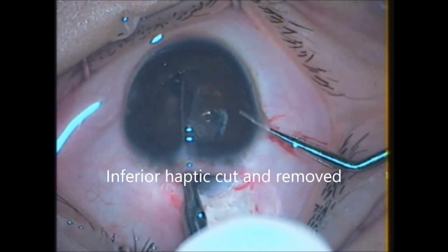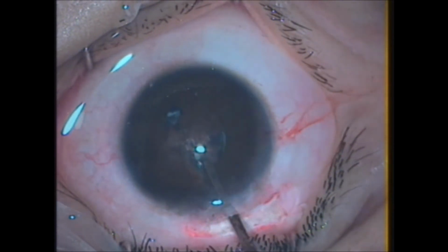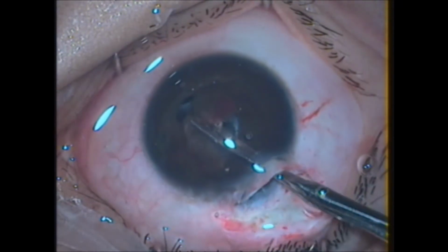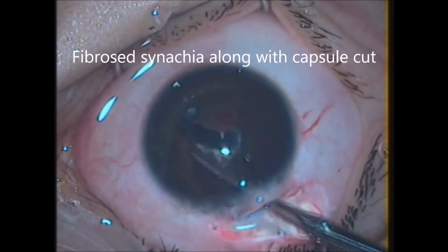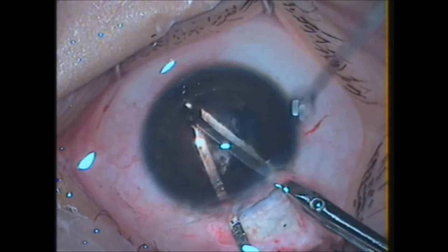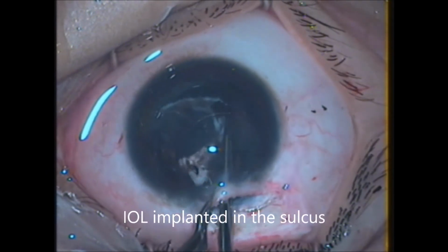This was a 12 year old boy, post-traumatic cataract, operated somewhere and got both the haptics in front, total posterior synechia. The inferior haptic was difficult to remove, so it was cut and the IOL was removed. Total posterior synechia, very difficult to separate with the iris repositor. So these synechias were cut along with the posterior capsule. And then the iris repositor was placed between the capsule and the iris, and they were cut, and space is created between the iris and the posterior capsule.